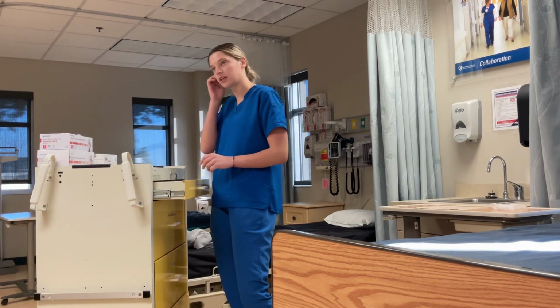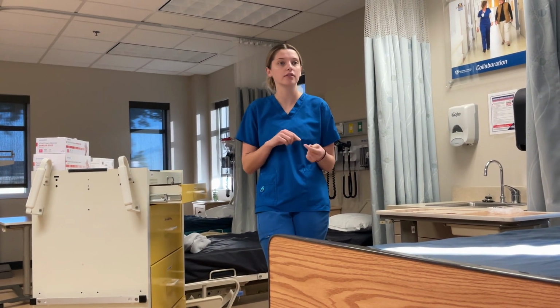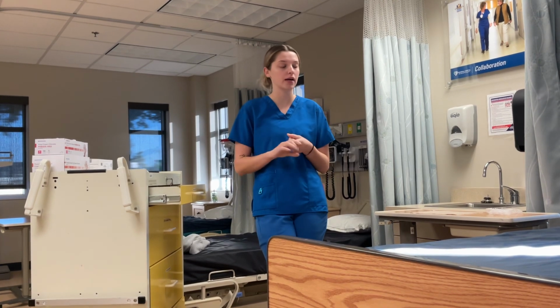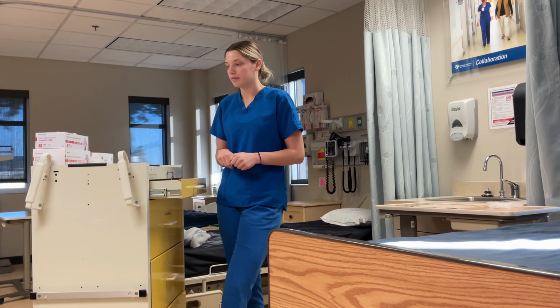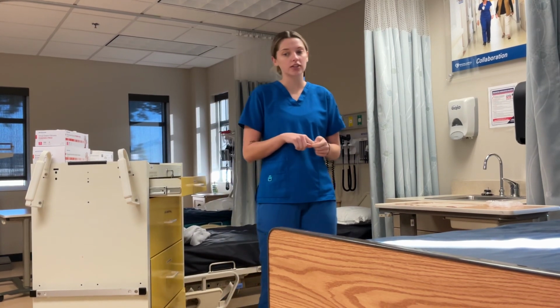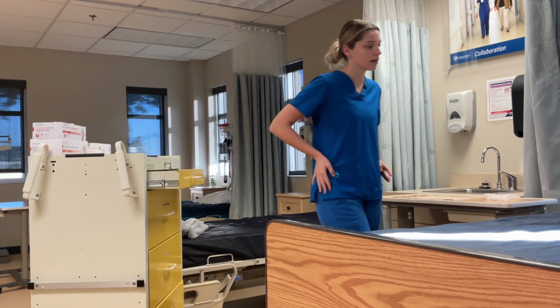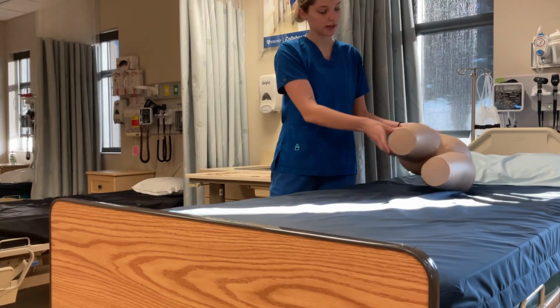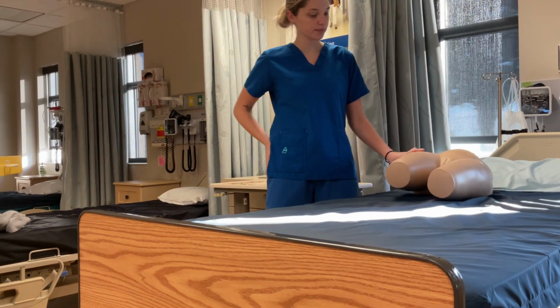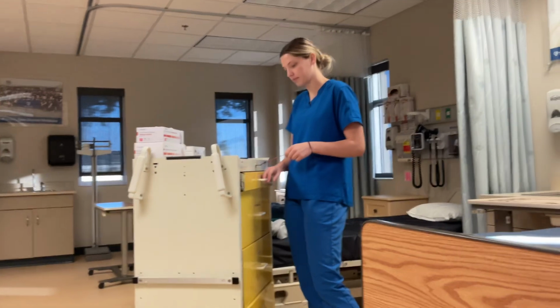Today I will be using a 1.5 inch 22 gauge, and that is because it's appropriate for what I'm given today and my patient's age and size. I would ask my patient if they have a preference on what hip that's going to be given today, and for the purpose of today, it is going to be given on the right hip.